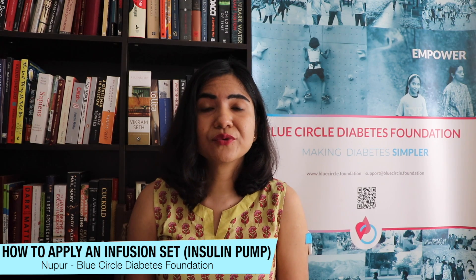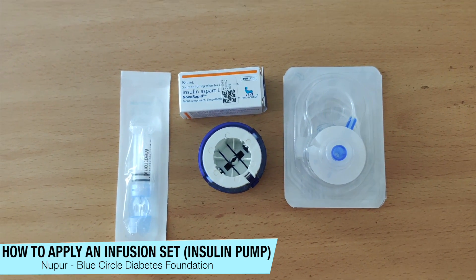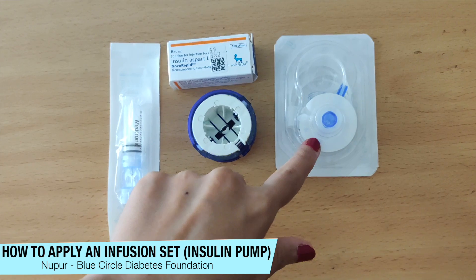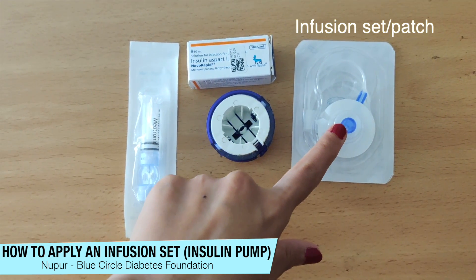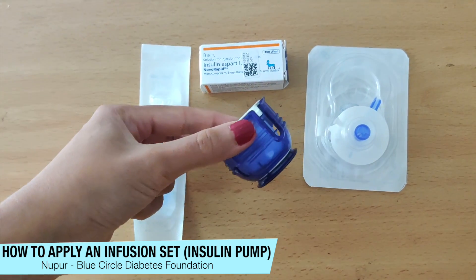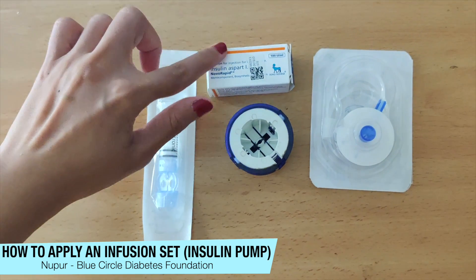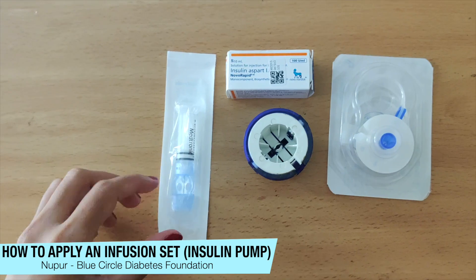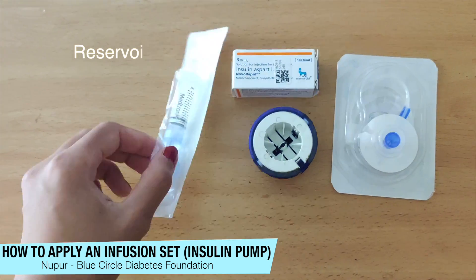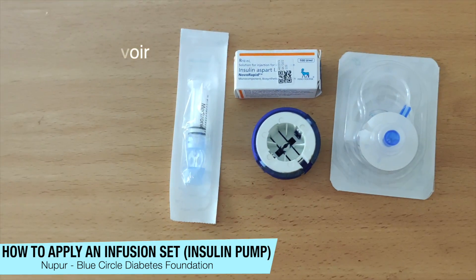Now I'm going to show you what goes into changing a patch. These are the things you need: this is the infusion set or the patch that goes on your body — you're going to inject this. This device is called a Serter — you fix the patch into the Serter. This is my insulin; you can use a cartridge or vial. And this is called a reservoir. The infusion set and the reservoir are the consumables.